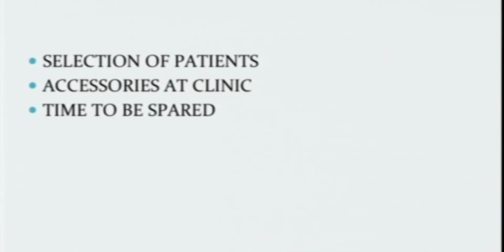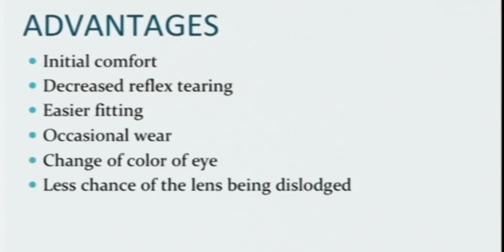And then if you want a selective range of patients for higher contact lenses like ortho K or other lenses, we need to have a topographer. And more important is the time to be spared, because you need more time to spend with these patients to motivate them for fitting and then for post-fitting methods. The advantage in the contact lens is the initial comfort, but for some it might be a little bit of discomfort, watering will be there.